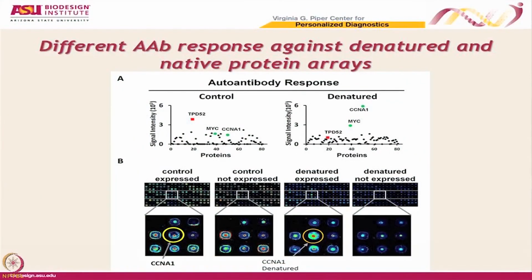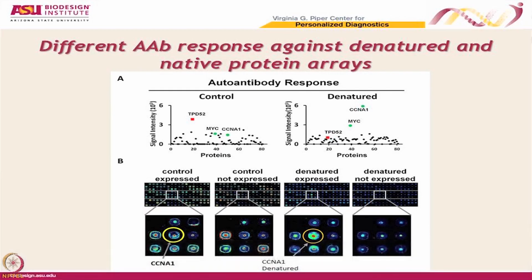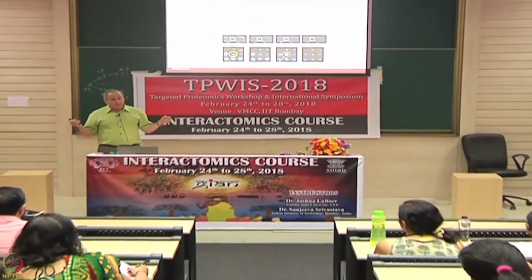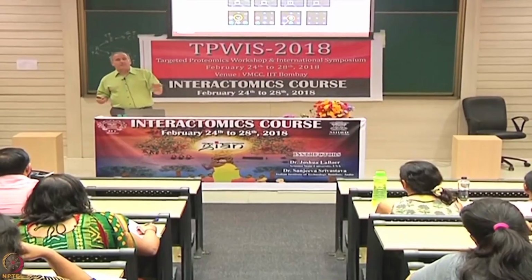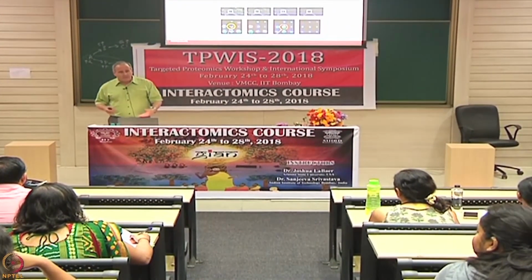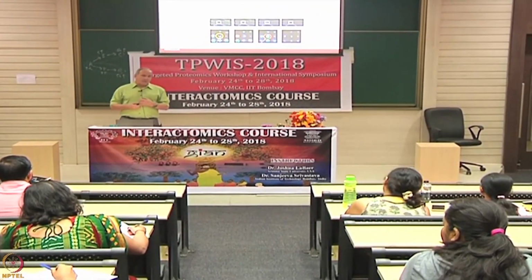Okay. So then, no. The array was denatured. Then it was washed and then treated with physiological buffer. So the proteins were all stretched out on the array surface. You denature the array, then you rinse off the SDS, and you bring it back to room temperature, and now you added folded antibody. Because if you denatured the antibody, it wouldn't work. Or most antibodies don't work.